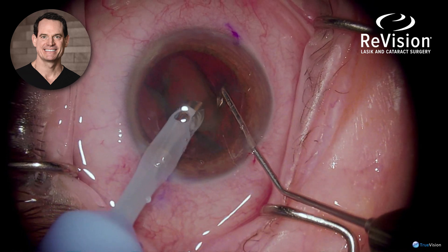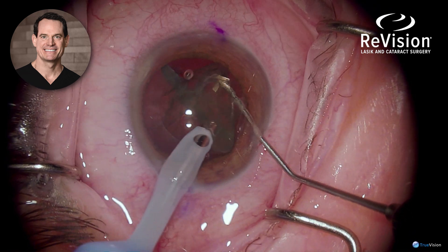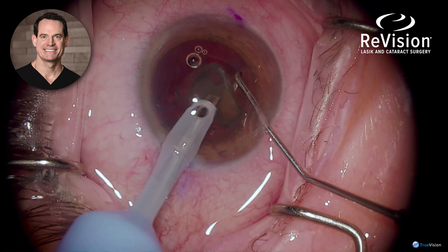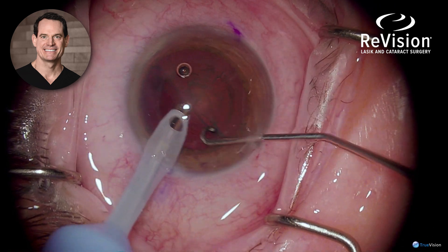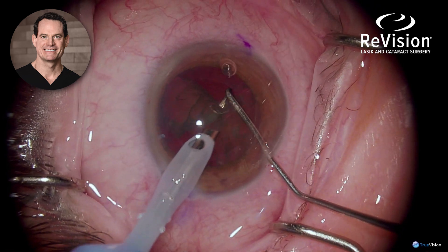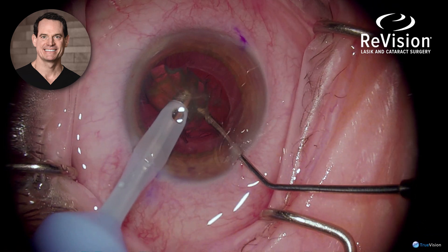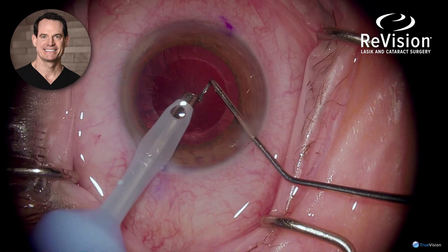Each quadrant is then removed. It's then time to remove the final quadrant of the lens, and I place the chopper behind so the posterior capsule does not come to the phaco tip and cause posterior capsule rupture.